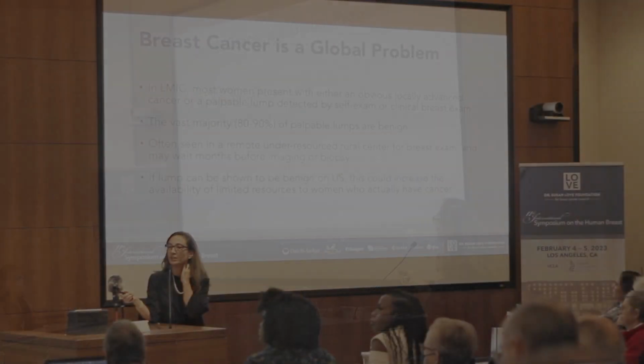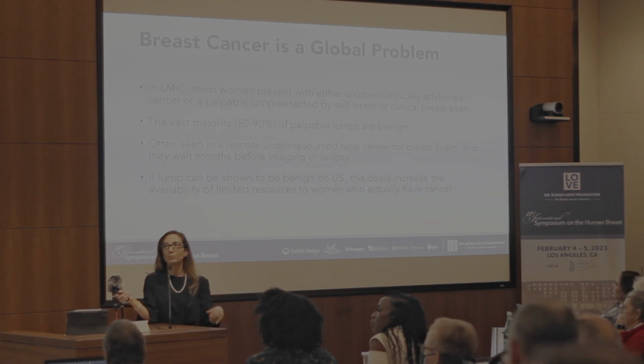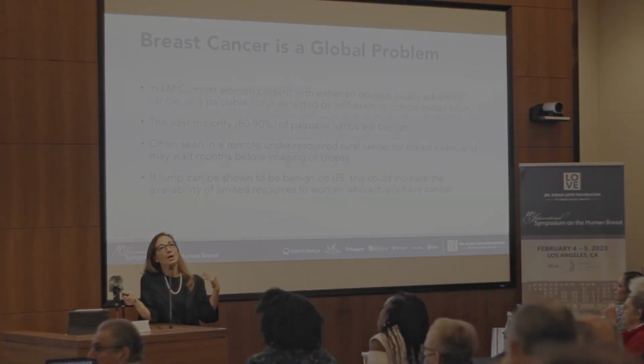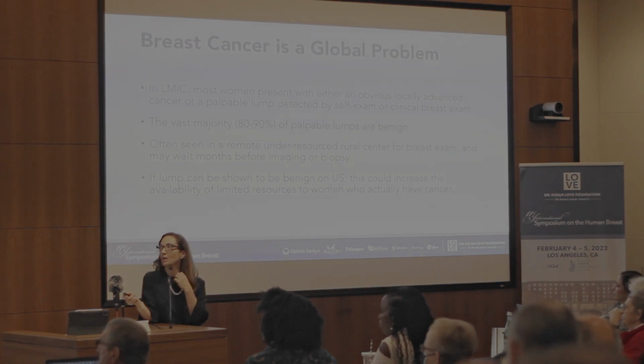Most women either present with locally advanced cancer or a palpable lump. Most of the palpable lumps, 80 to 90%, are benign. So it'd be great if we can diagnose this with an ultrasound early on, so we can use the resources for women who do actually have cancer.